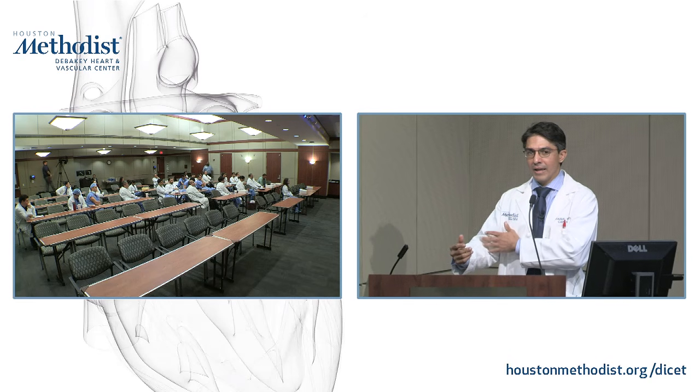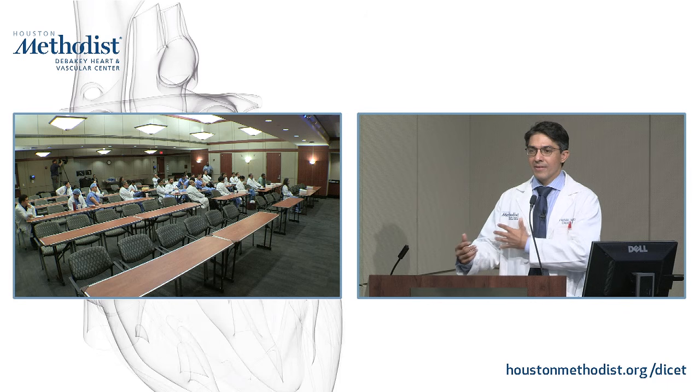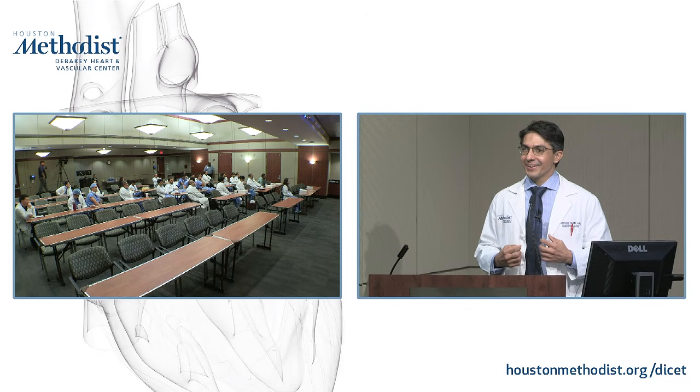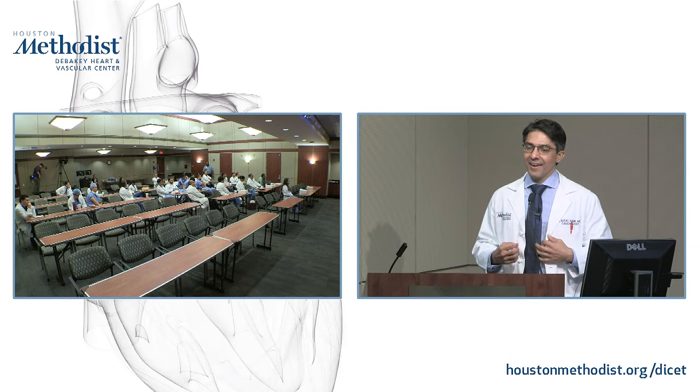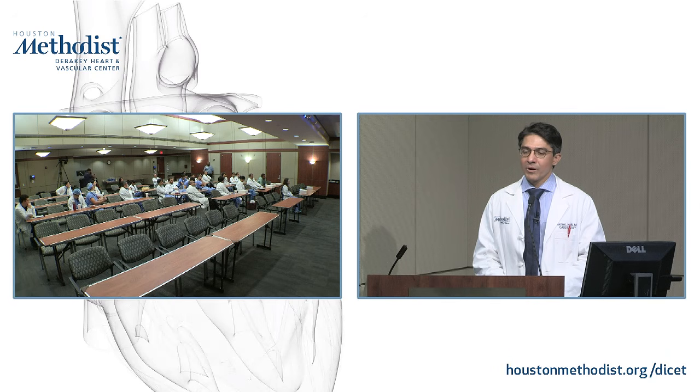I don't know who may have had a CT, but supposedly it feels very warm. And so patients may gasp or Valsalva a little bit, and this scanner has taken its pictures by then. So we're very systematic, very conscientious about really talking to them and stressing to them, please be motionless.